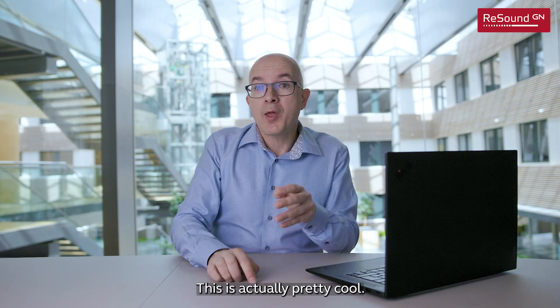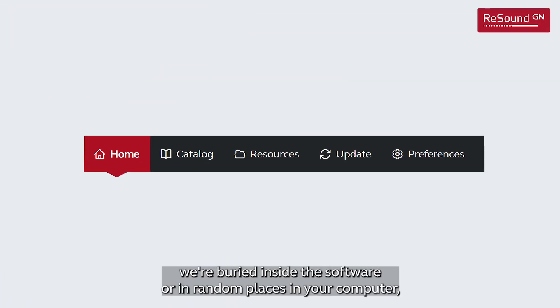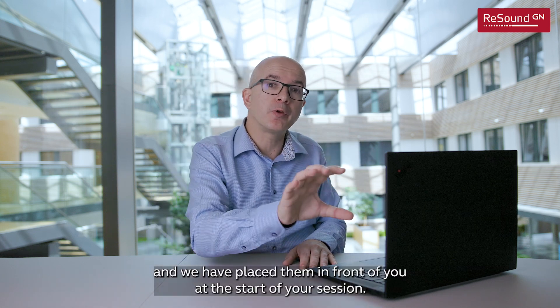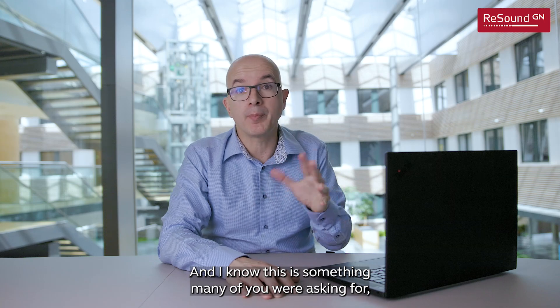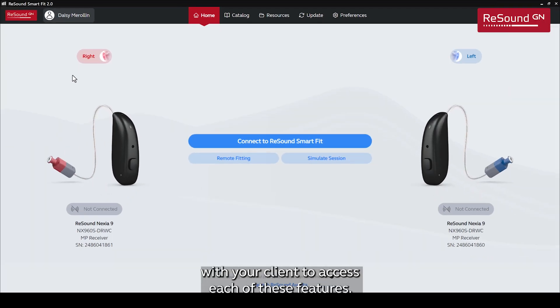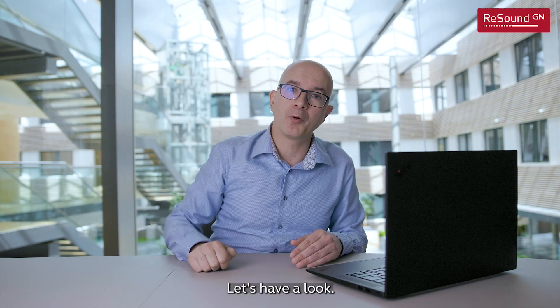This is actually pretty cool. We have pulled out many functions that until now were buried inside the software or in random places on your computer, and placed them in front of you at the start of your session. I know this is something that many of you were asking for, because now there is no need to start a session with your client to access each of these features.